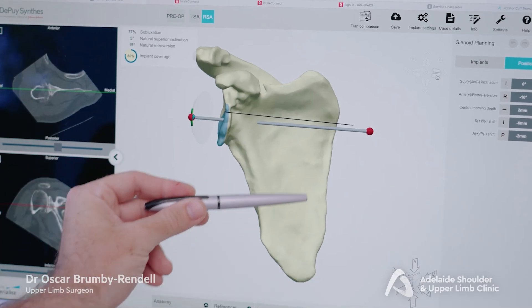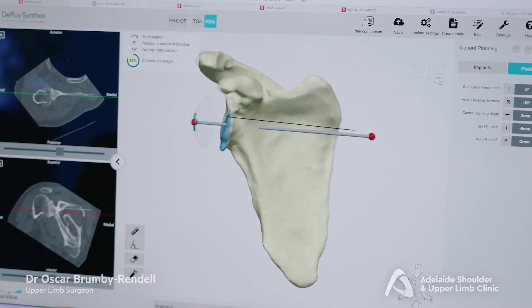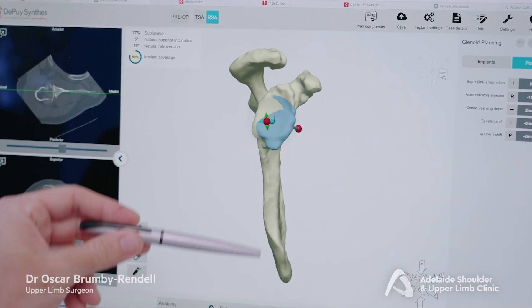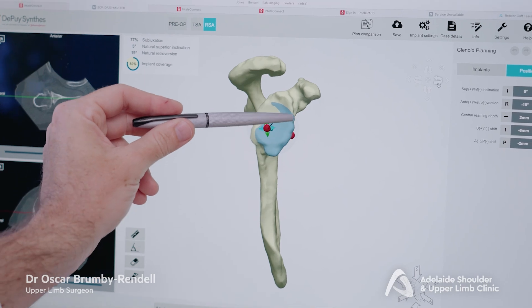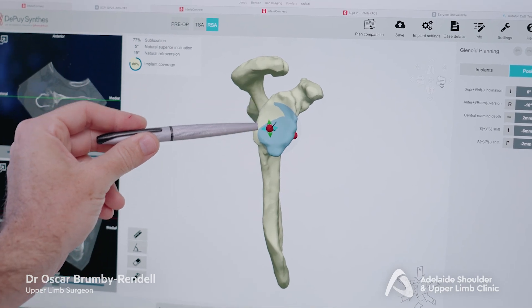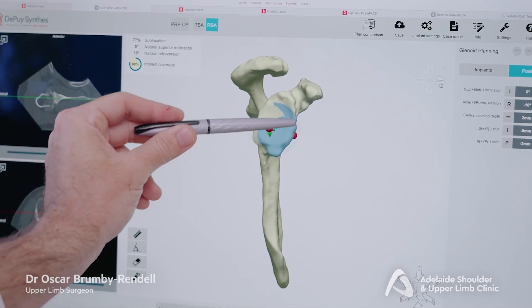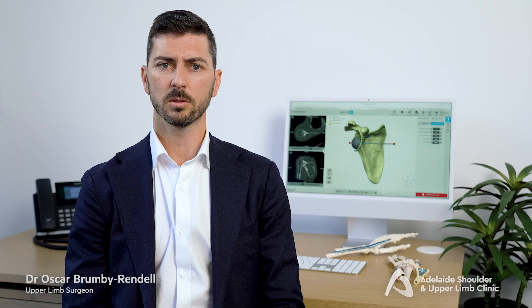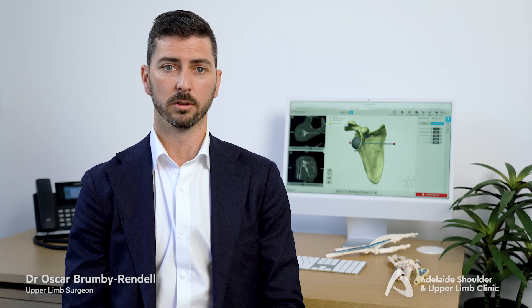Here you can see the view of a scapula, or shoulder blade. The scapula socket, called the glenoid, is a small area of bone, so getting the components in the right spot is important.